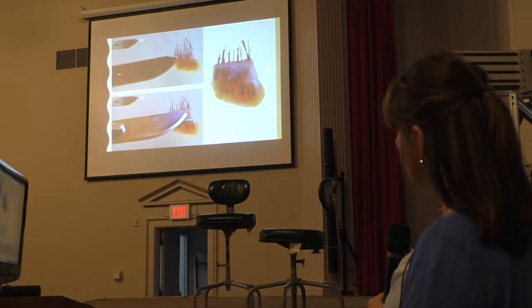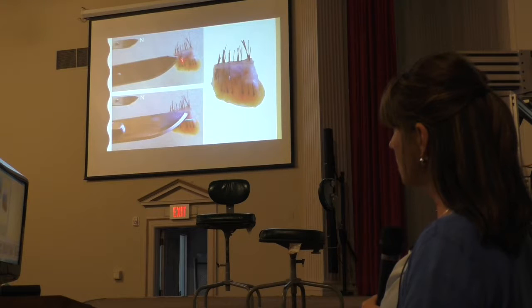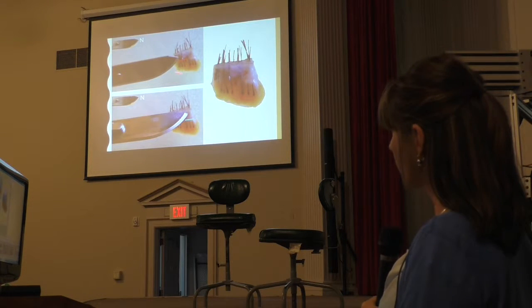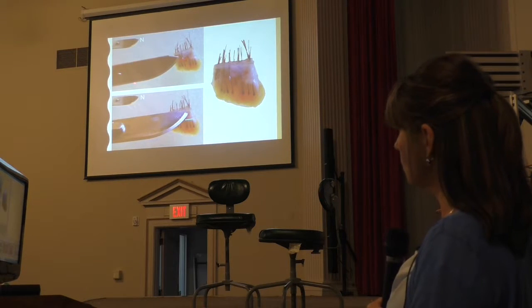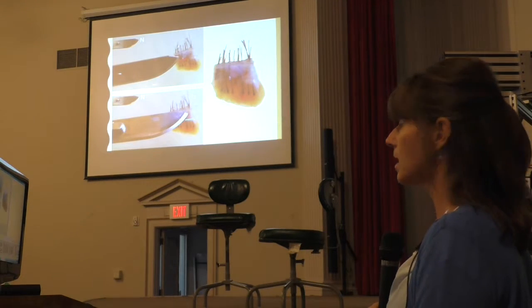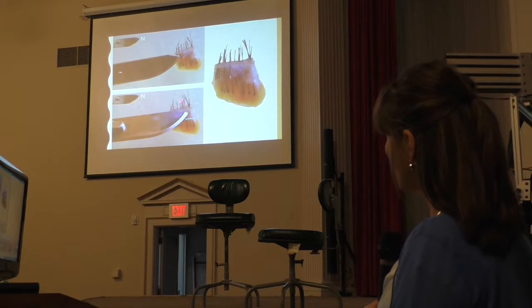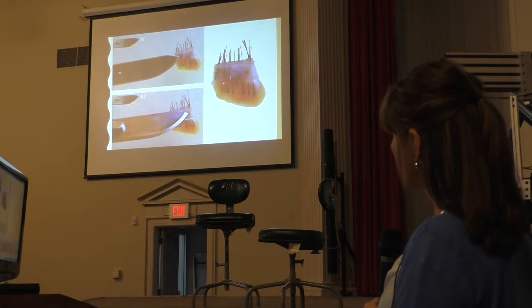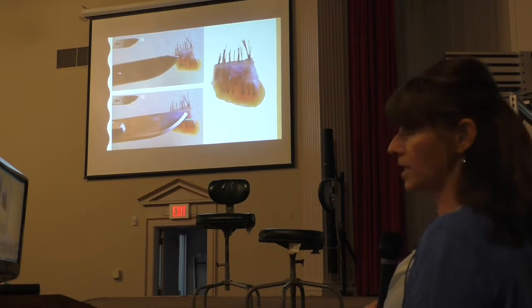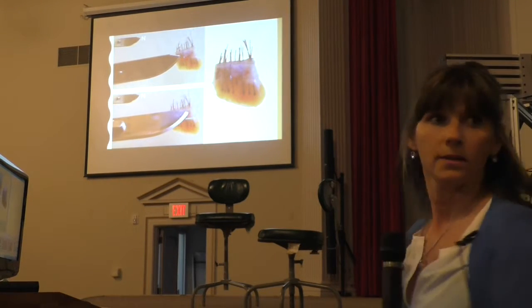This sliver has 2 types of transection. One is by the blade angling toward the tissue and cutting that way. Can you see, this is the edge you see more, and a sharp edge was facing toward the sliver. Can you see that? And then this portion happened by tilting the blade, so it was, oh, I made a transection, I overcorrected, now I made a transection here. Can you see that? Okay, good.